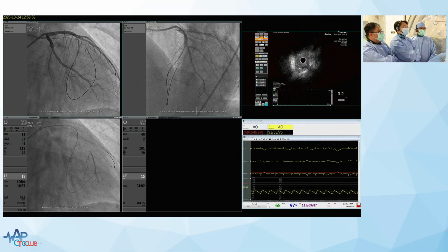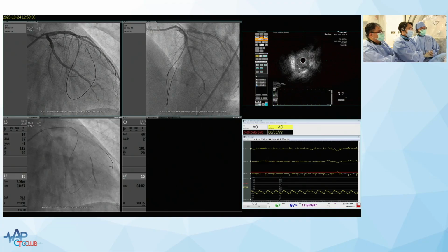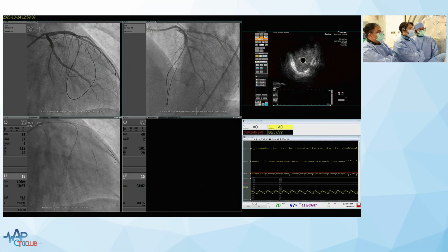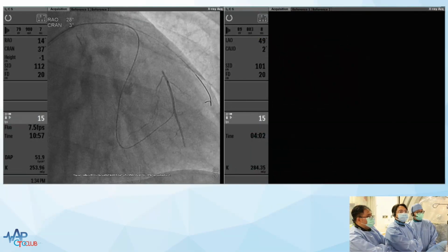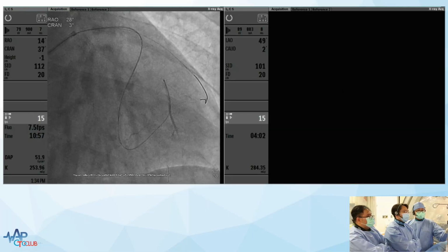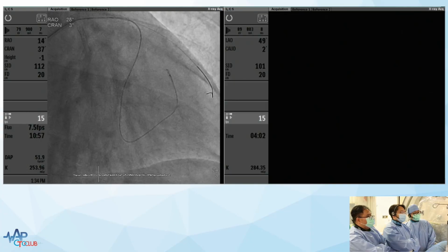Okay. So I agree with Scott that this is not the usual approach because, as we discussed before, the proximal cap is very likely to be a very tough cap. Yeah, that's exactly it. So we may have to prepare the antegrade proximal cap first. But indeed, the procedure is super smooth at this point. It's only around 1 to 2 minutes.